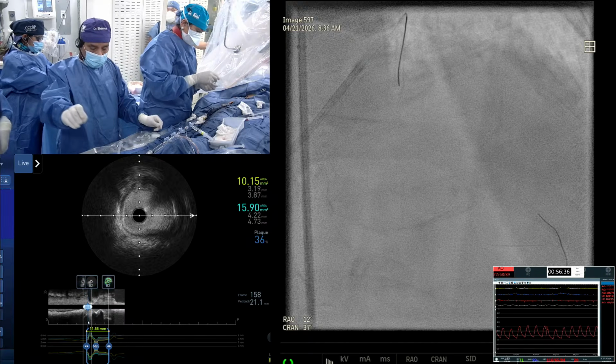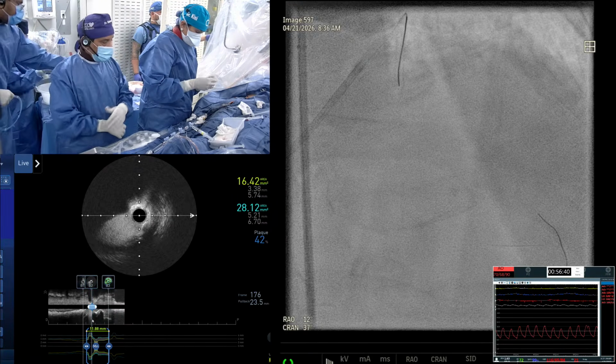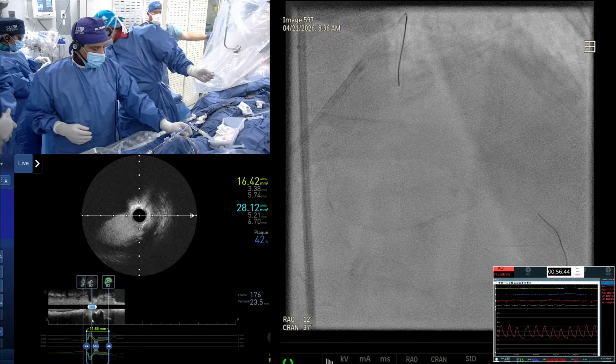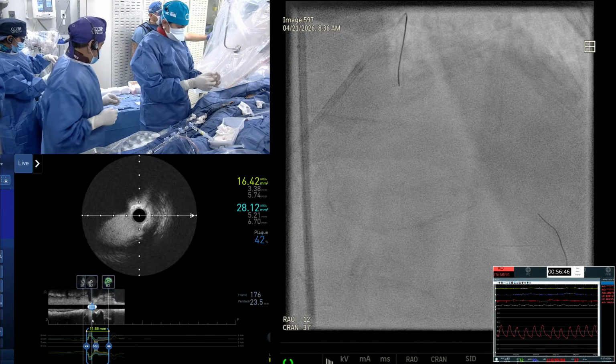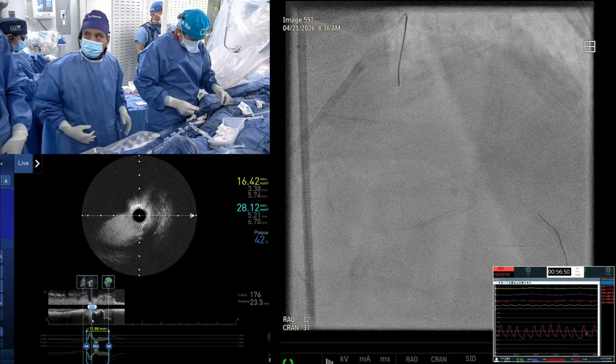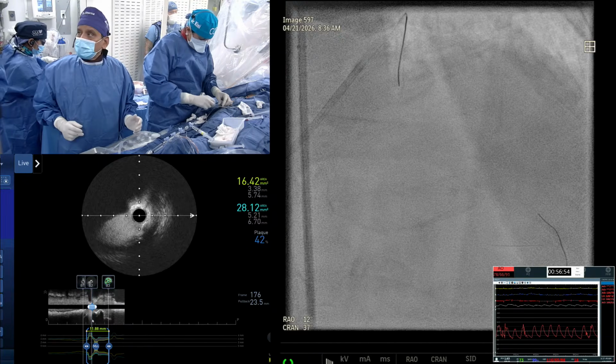And he showed the differences between the FC and regular Fielder, that slide. Did you see that? Can we put that slide back up again? I don't know if they can see it on that small screen. Yeah, we were able to see it, but it was on the small screen. Yeah, Philip will help you there.